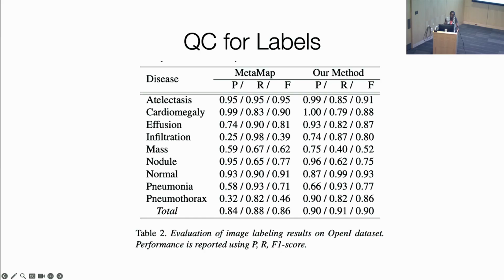So when you pick your dataset, you may just see labels, but at least you should do the work to figure out, is it human annotators? And human annotators means you give them a chest x-ray and you say, label. Okay, and they don't dictate, you just give them a list of the labels and they come up with the labels. Usually, and we've done this, and I'll show you our experience doing this type of labeling.